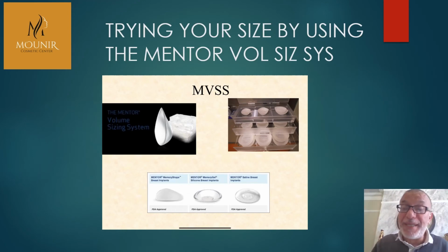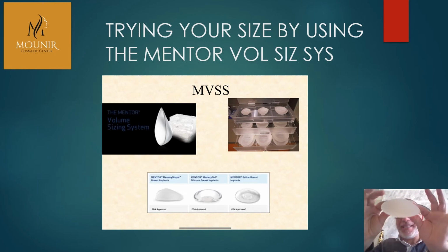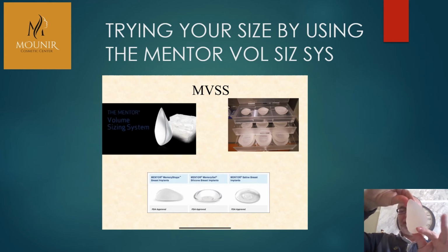So sometimes patients think this is the implant they are going to have. Actually, no, the implant really depends on whether you are going to have a round implant, it will be this one, or it's going to be this one if you are choosing to have a teardrop implant. I had one here, so it's here. So it will be this one here. So that's the teardrop implant. It's flatter at the top, fuller at the bottom.